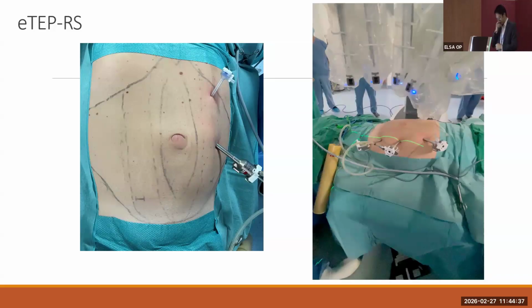Okay, so you can see this patient actually has a not that huge umbilical hernia, but he does have a fairly significant rectus diastasis. And studies have shown that if you have a concomitant rectus diastasis, you should repair it together with the umbilical hernia. If you only repair the umbilical hernia, you predispose the patient to getting a recurrence if you do not repair the rectus diastasis. Okay, in the photo on the right, you can see that in this particular setting, we're using robotic surgery. This is the da Vinci system which we have here in our institution.